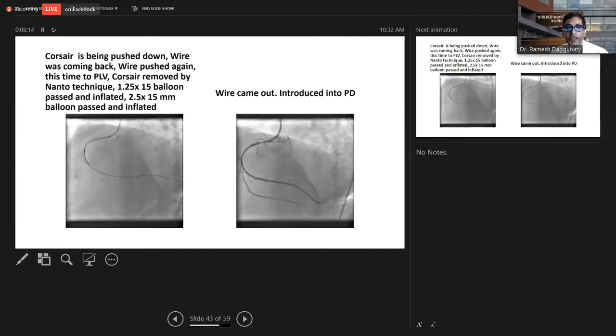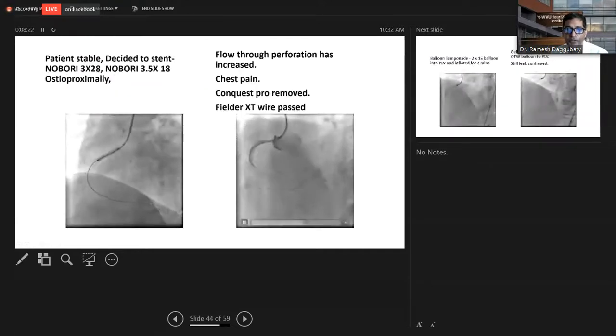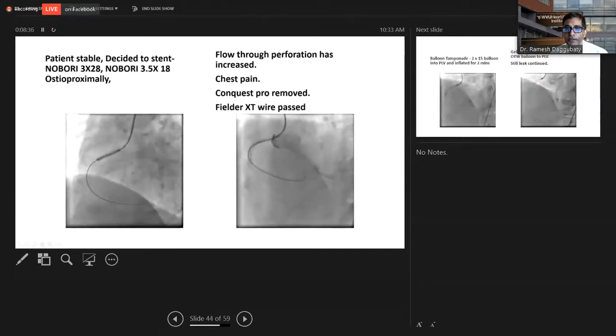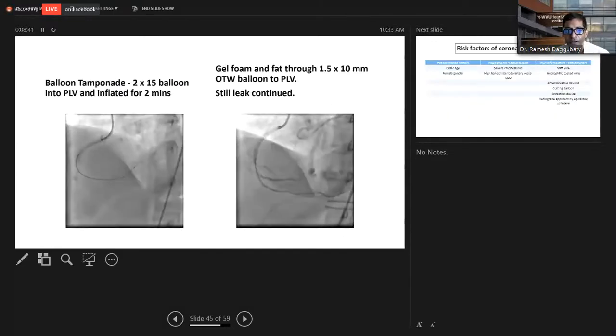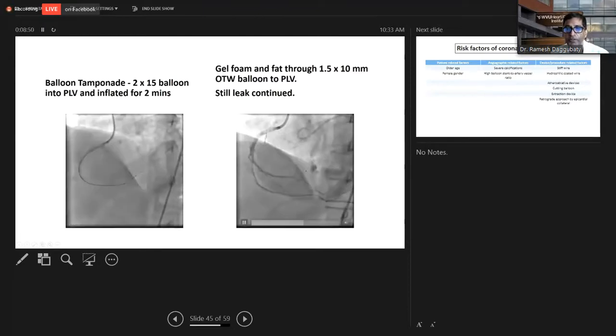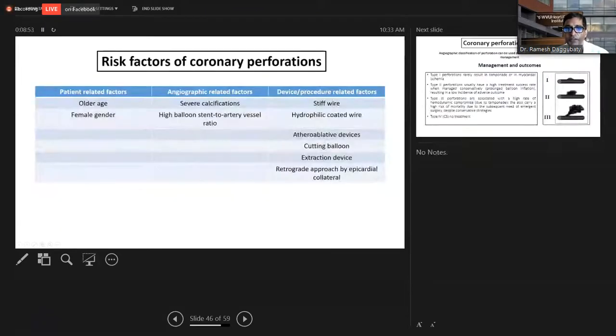You know, once you cross it, make sure your wire is in the screen of your II, and don't keep on changing it. So here again, one more time, another wire, but hopefully, if you saw it in the previous picture here itself, you could see that there's a blush in the posterolateral branch, perforation again, a distal wire perforation. And then that became bigger because it was not recognized. And so then balloon tamponade was done, but it was too distal. I think we are now making it worse by putting the balloon in the place where there was already a perforation and creating it much bigger.